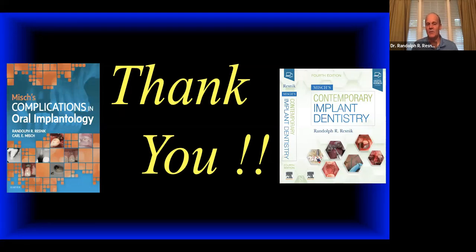The only reason I would bypass the sinus is if there was a developmental or a pathologic reason that you couldn't go into that sinus. And that is so rare that it would just be very rare. So zygomatic implants, pterygoid plate implants, in the studies out there do have good success rates, but they're very invasive and they're not shy of complications. So I think it's a lot simpler and easier to do lateral wall sinus grafts or crestal grafts.